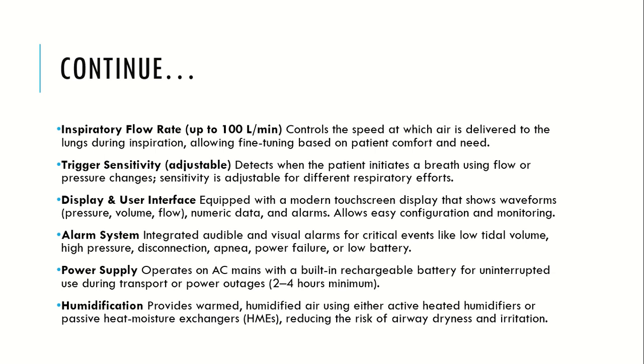So here too we will see that the inspiratory flow rate is up to 100 liters per minute. The trigger sensitivity is adjustable, so it detects pressure changes and adapts to the respiratory efforts by the patient.